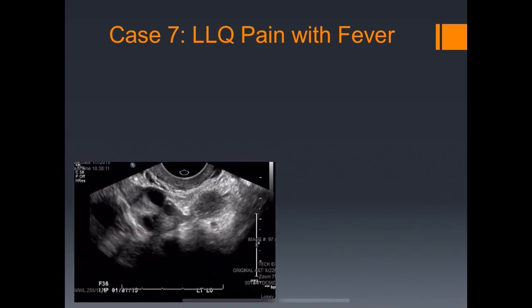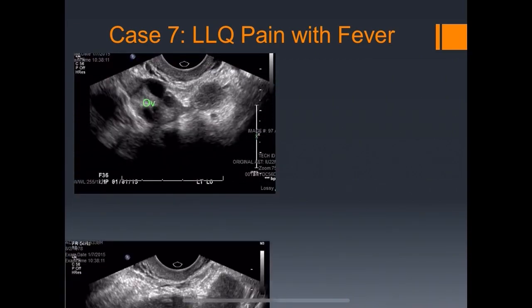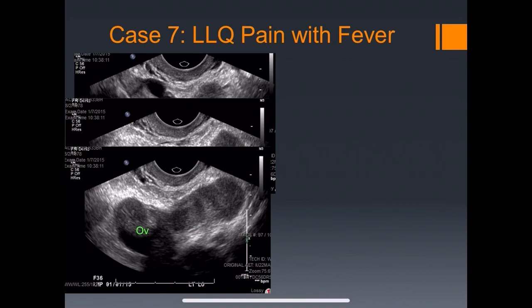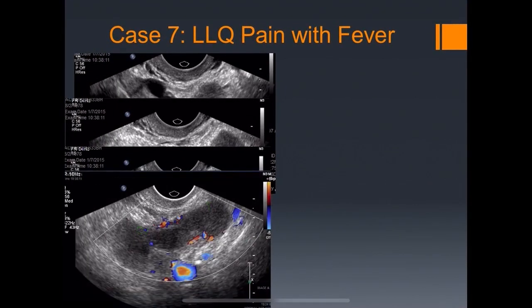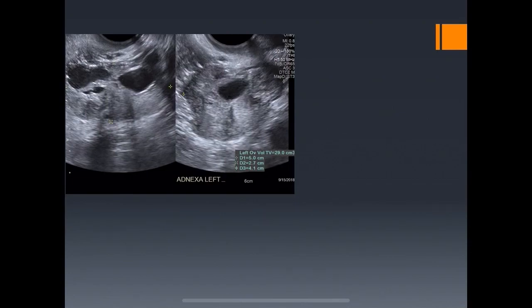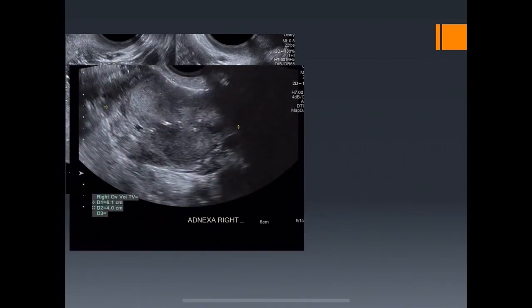Case seven: left lower quadrant pain with fever. We have the ovary and an adjacent structure. As we go sequentially down through the adnexa, a tubular structure starts to elongate. Notice the thickened wall, debris within the tube, and peripheral echogenicity suggesting inflammation. This turned out to be a pyosalpinx — an inflamed and obstructed fallopian tube.